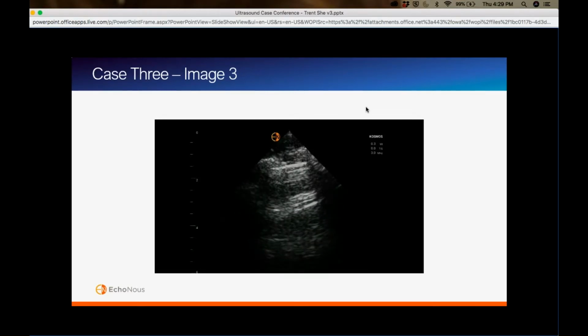Have you ever seen this before? Or did you look through any literature and find anything as far as this being common? Yeah, so I was like, no way, it doesn't look like there's lung sliding at all. And I did look up some cases, there are some examples of when you have absent lung sliding. It doesn't necessarily mean pneumothorax, like patients who've had that surgery, who are main stem intubated in the other lung, they won't have lung sliding either.